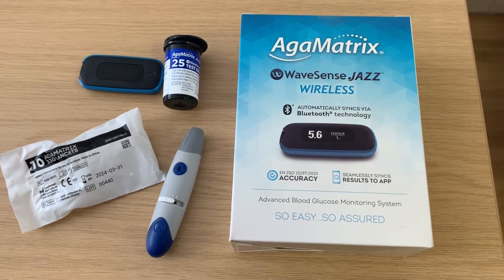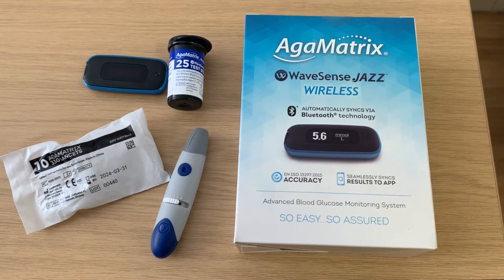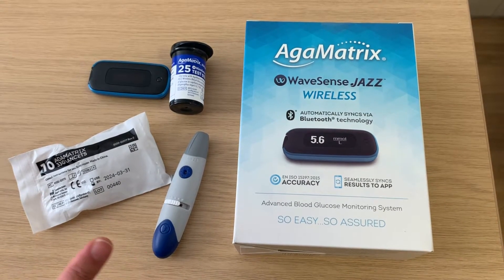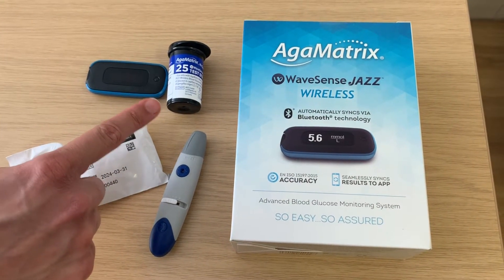In this video we will show you how to use the AgaMatrix WaveSense Jazz Wireless Blood Glucose Meter. You will need the finger pricking device, also known as the lancing device, the needles or lancets, the blood glucose strips, and the meter.